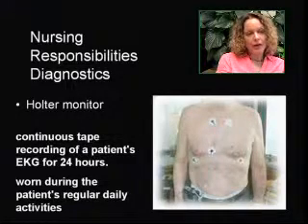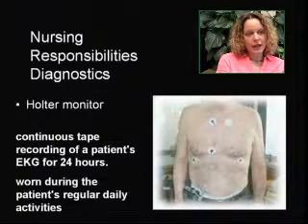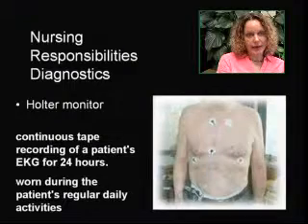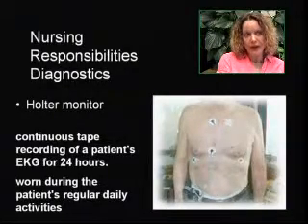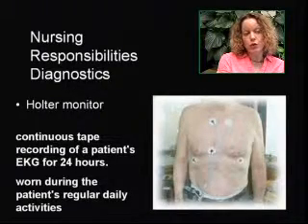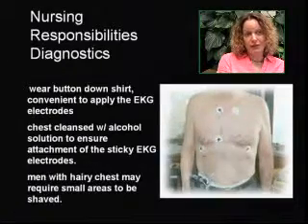So you can have an EKG tracing done while you're laying in a bed at rest with the electrodes placed and a tracing. We can also do something referred to as a Holter monitor. And this is a continuous tape recording of a patient's EKG for 24 hours. So it's worn during regular daily activities.